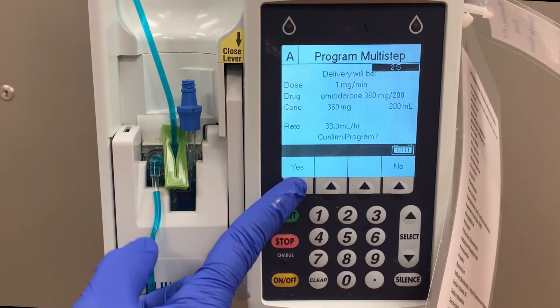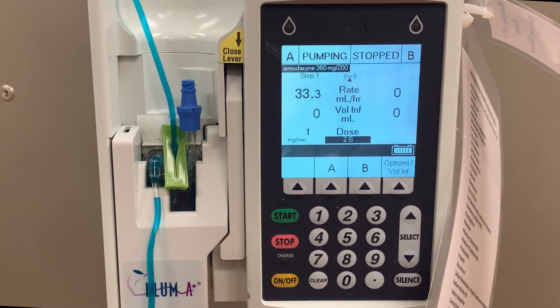Verify that the starting rate is correct and press Yes. Now your pump should begin to run at the initial rate, and at the designated time, it will change to the second setting.